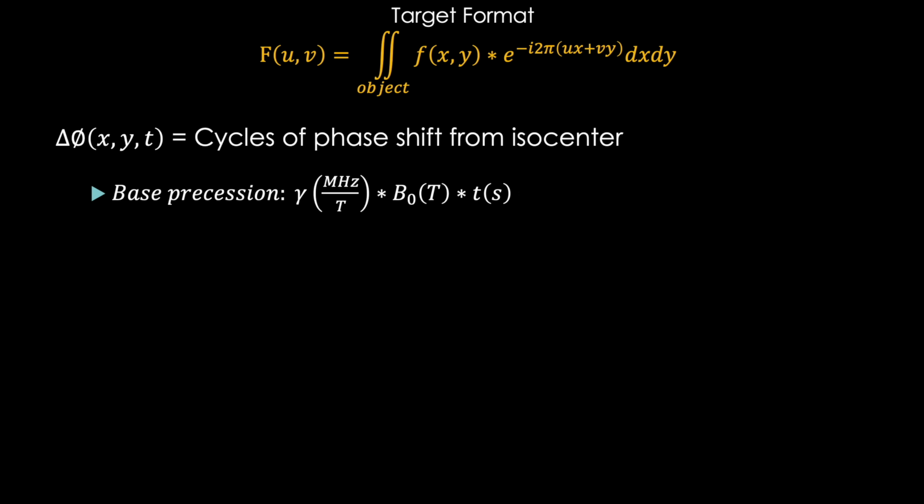If we multiply these units out, the Teslas will drop out. We then need to define what a megahertz is. 1 hertz is equal to a cycle per second. Forget about the mega part here, it's just a constant, and we're really only worried about the units here. With the addition of this term, you can see that the megahertz drop out.